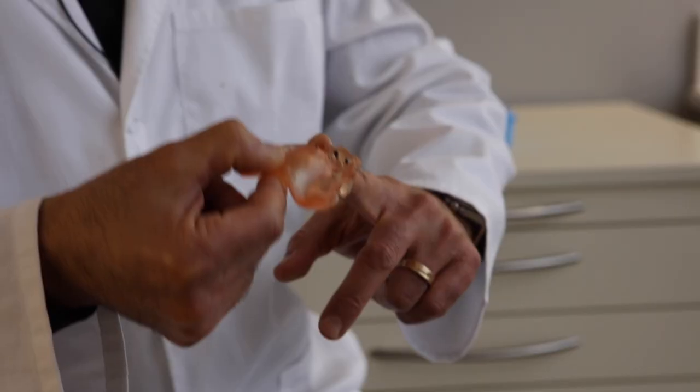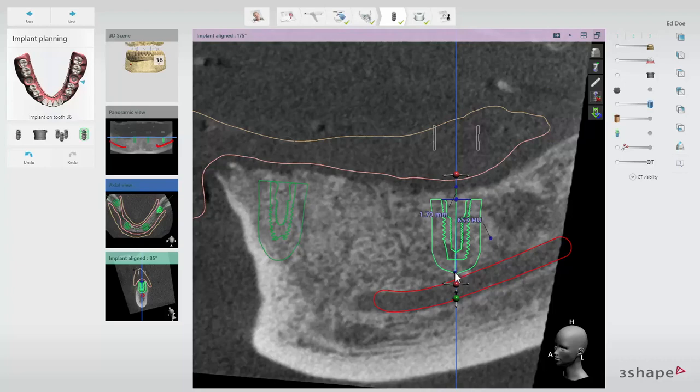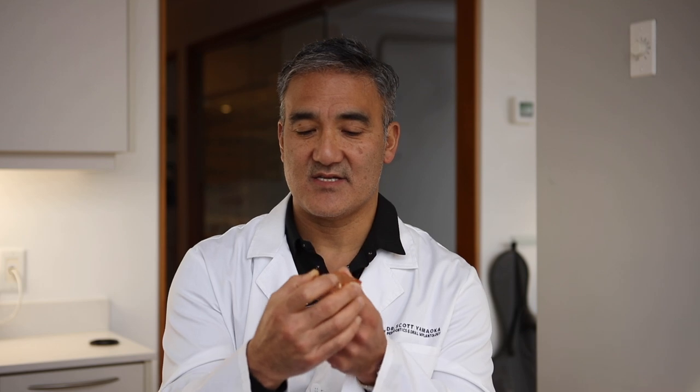After you've made your pilot osteotomies, remove the stabilization pins, remove the guide, flap the case, and evaluate your access points, directions, and angulations. Ensure they match what you planned on your cone beam CT scan implant workup software. If you appear to be accurate and have the bone as planned, you can place the guide back in with the case flapped, utilizing the palatal mucosa and the reinserted stabilization pins to stabilize it, then continue with your osteotomies.